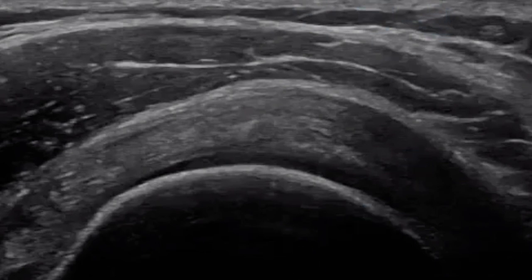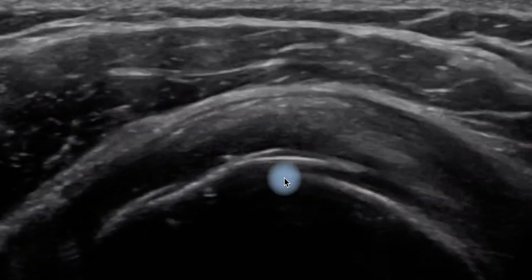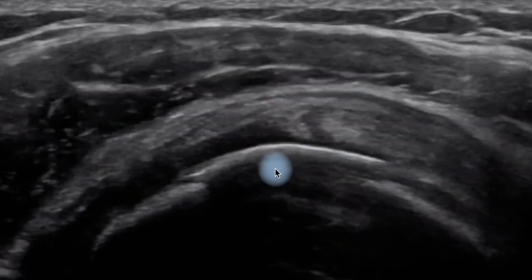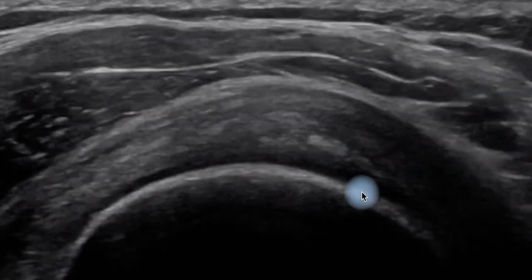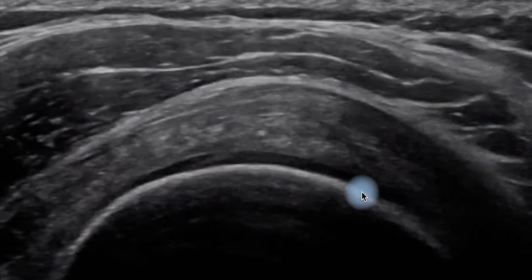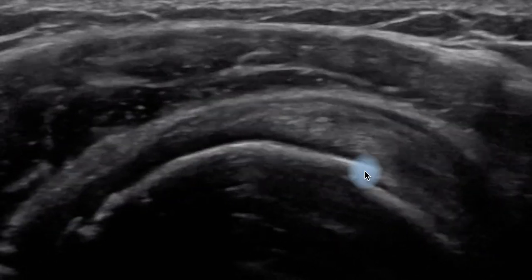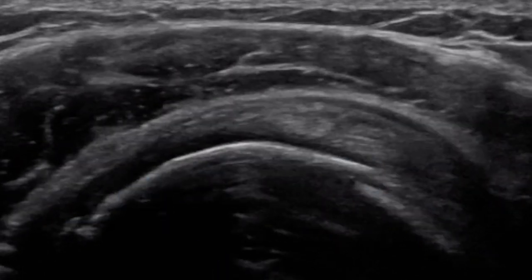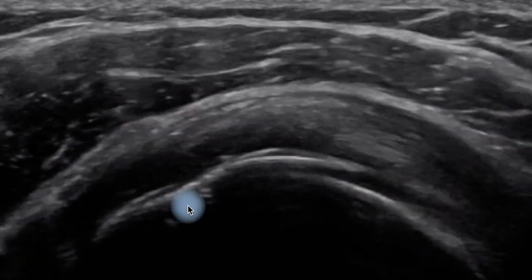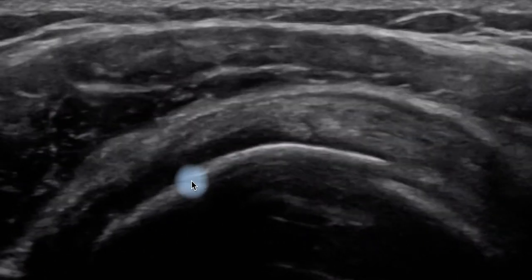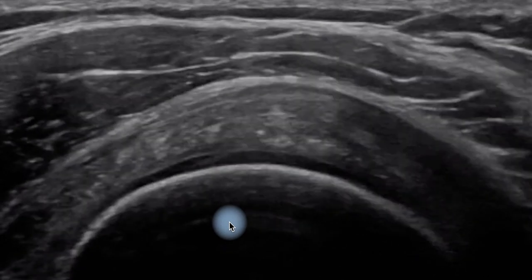Now playing the video, you'll see that the smooth outline of the cortex of the humeral head changes — it becomes very ragged and irregular, and you've got these classic step deformities where there's an undisplaced fracture of the greater tuberosity. You can see it classically here as a step. If we do it once more, you'll see on this side there's another little step between the bony cortex and outline.